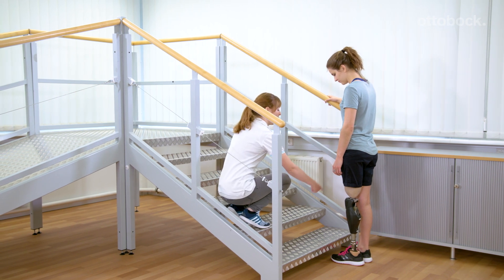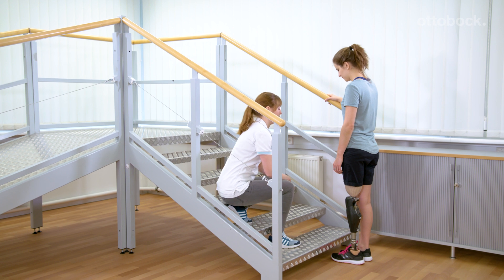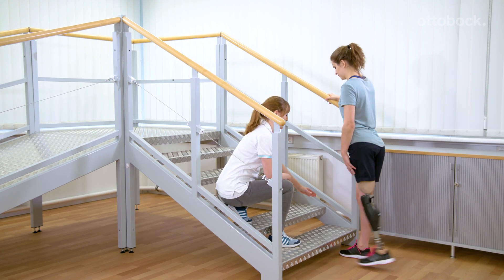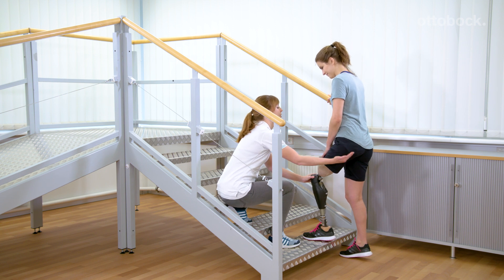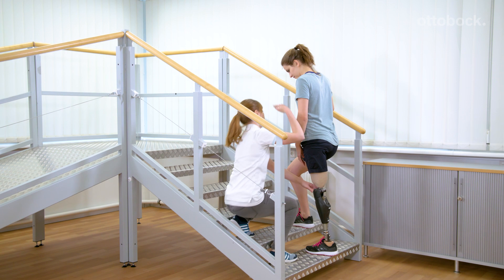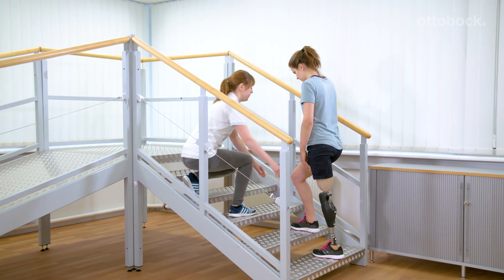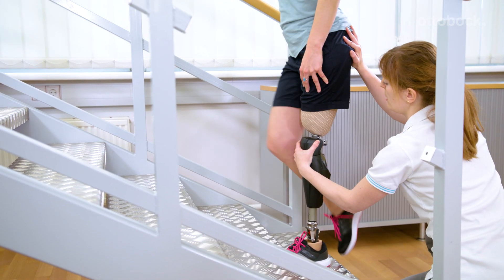The fundamental exercises for the stairs and obstacle function are put into practice: triggering the function, foot placement, and finally stepping up. Use the contralateral handrail at first since this provides the best support. You can support foot placement and hip extension.